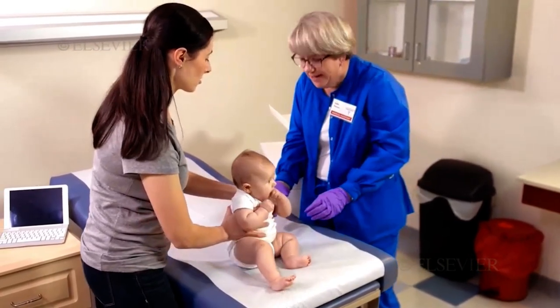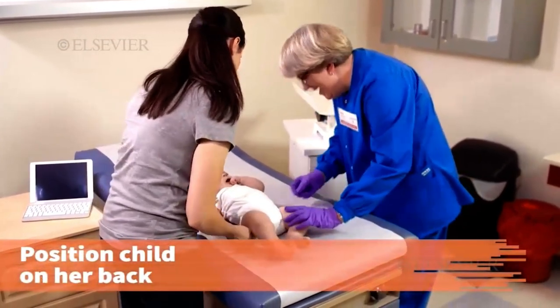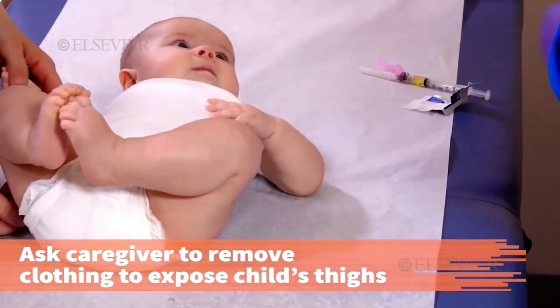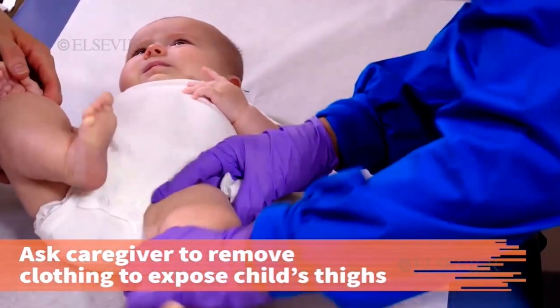Can I have you lay her down for me? Position the child on her back. Ask the caregiver to remove any clothing necessary to expose the child's thighs. It is important to expose the entire vastus lateralis muscle to prevent injury to the child.